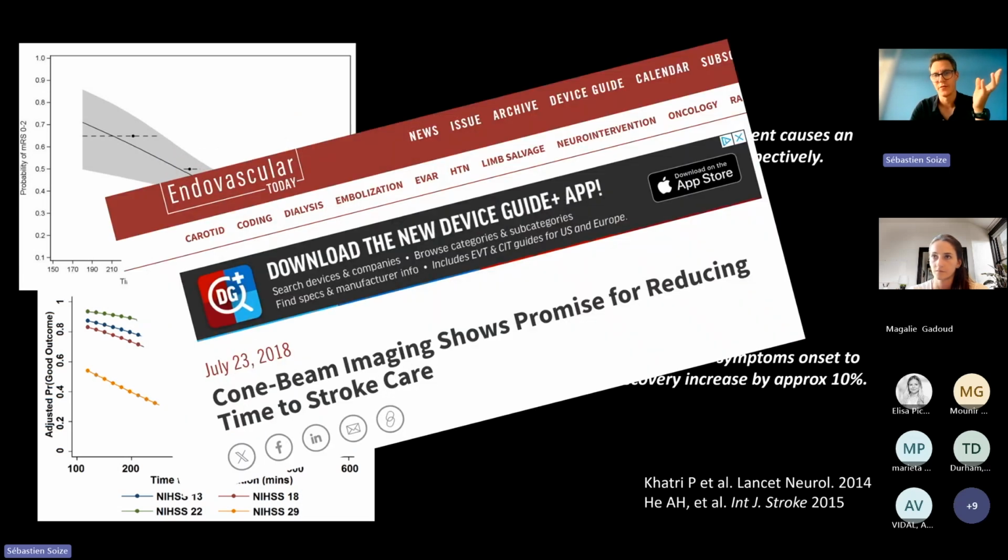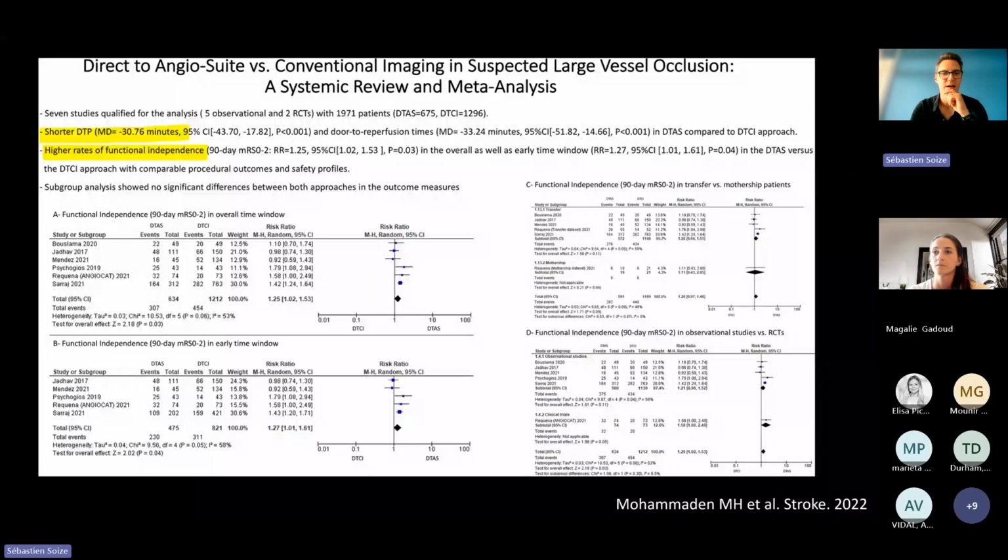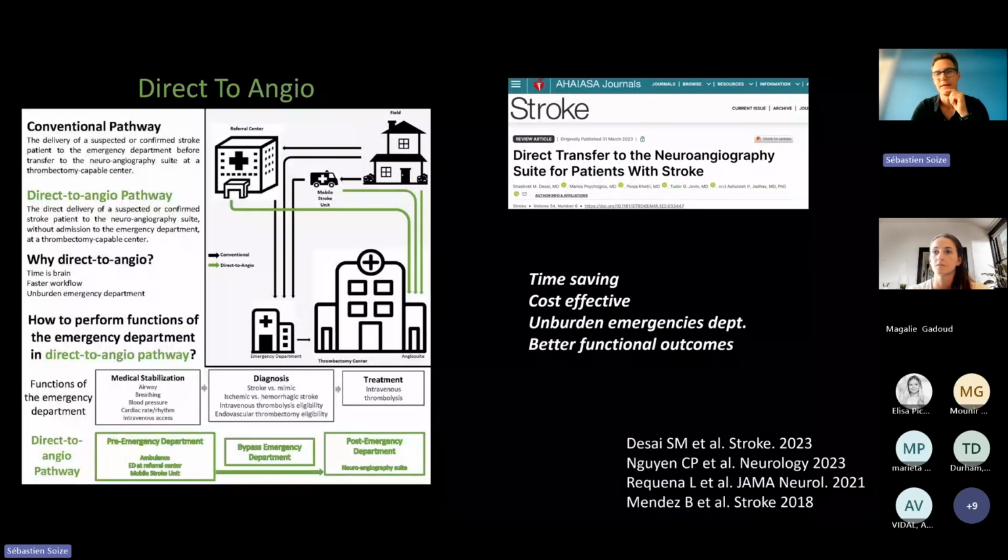Such an idea that CBCT can help the patient is not new. It started almost 10 years ago, only with plain non-contrast CBCT and CBCT with injection to see the occlusion, either arterial or venous. But the perfusion idea has been growing for just a few years. It started 10 years ago, but it has really worked only for a few years.